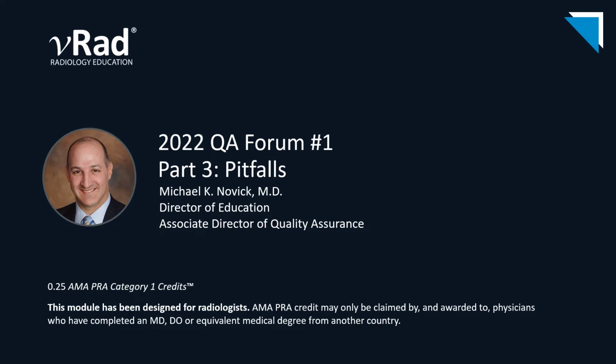We've spent some time recently talking about search pattern and satisfaction of search misses. Today I wanted to discuss some other common pitfalls we face in diagnostic radiology.